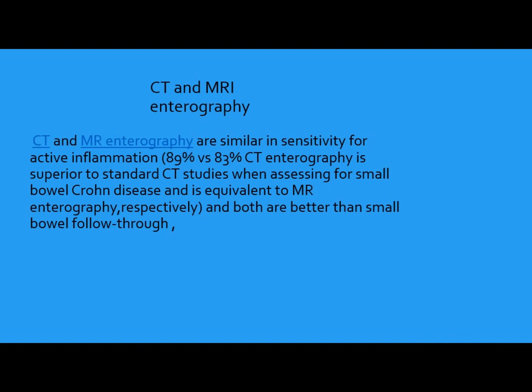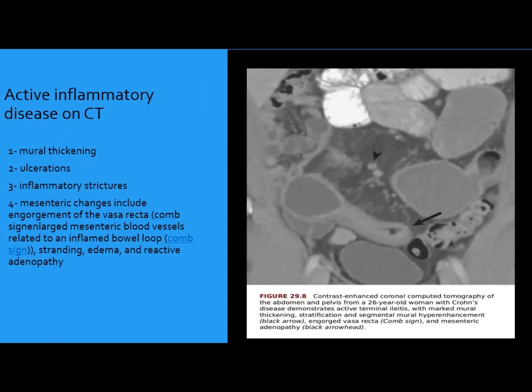After fluoroscopy, we can use CT and MRI. Both are very good, but contrast CT is better than conventional CT, and MRI can also be used — both are better than barium follow-through. On CT in the acute phase, we have bowel wall thickening, ulceration, stricture, and mesenteric changes where we can find lymph nodes and engorgement of blood vessels. This is a double-contrast CT of the abdomen and pelvis in chronic disease showing bowel wall thickening and lymph node enlargement.